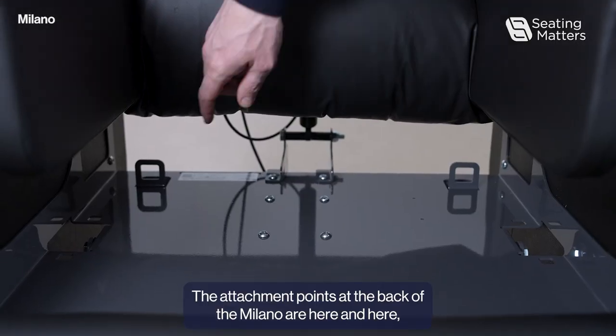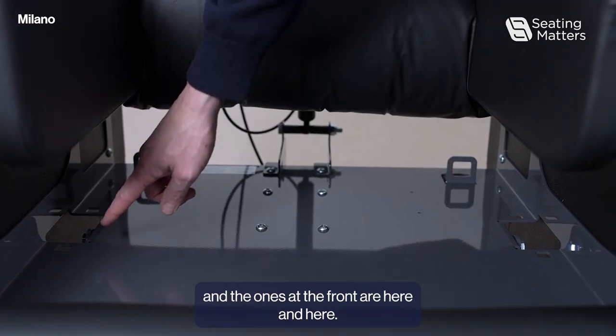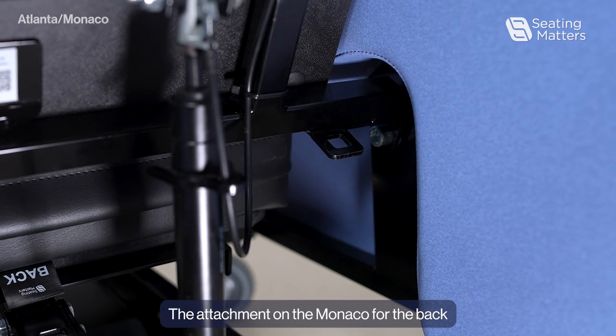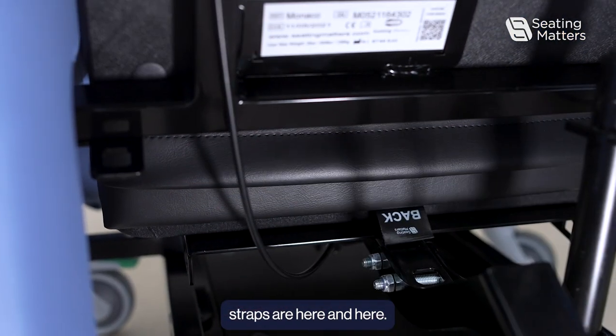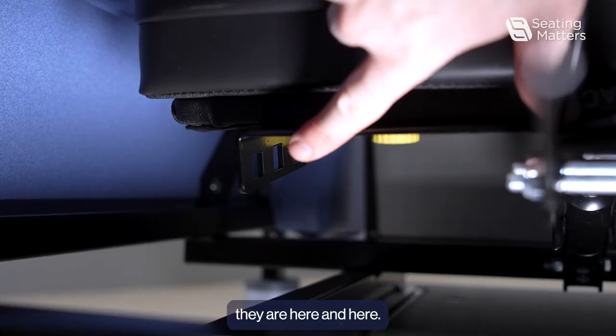Then we just slide the arm back into place and re-tighten the wing knobs. The attachment points at the back of the Milano are here and here, and the ones at the front are here and here. The attachment on the Monaco for the back straps are here and here, and for the forward straps, they are here and here.